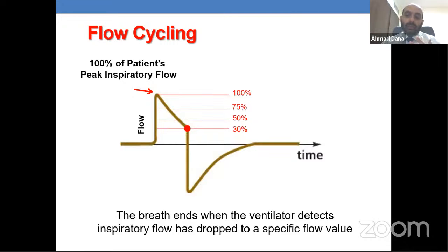When you set it as time cycled, in all assisted control ventilation, like SIMV, SIPPV, CMV, all modes of ventilation which depend on the ventilator, the ventilator determines everything by the I time. So the machine itself indicates what sort of I time we will give, and this, of course, is set by the doctor. So we are setting the I time. This is dependent on the machine.